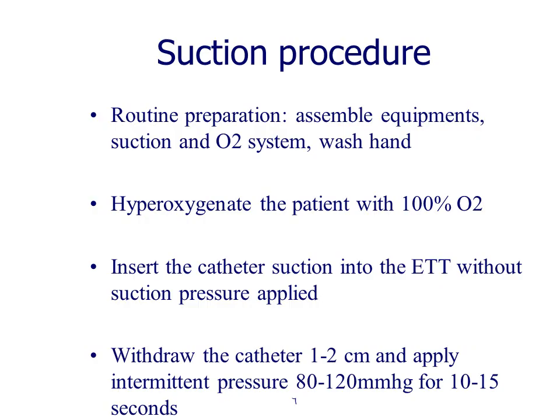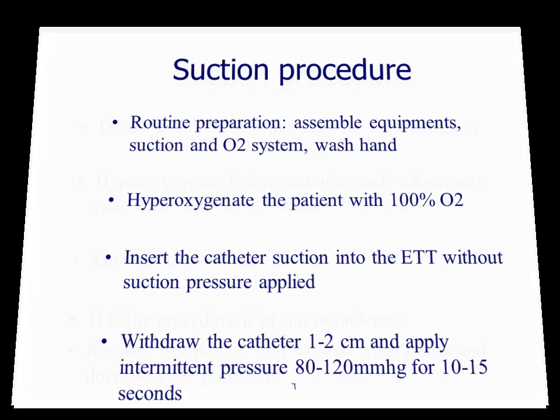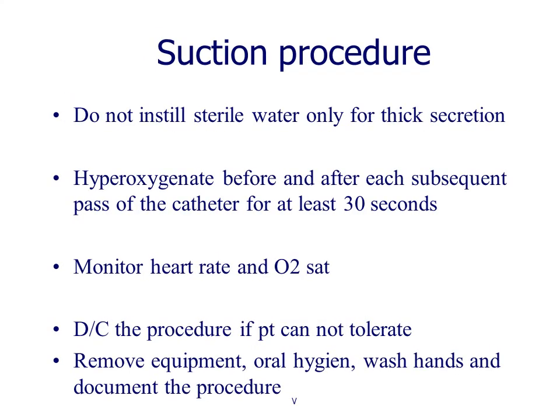We have to apply a pressure, and intermittent pressure is provided from 80 to 120 mmHg for 10 to 15 seconds, and then we withdraw the suction catheter. Do not instill sterile water, only for thick secretions.